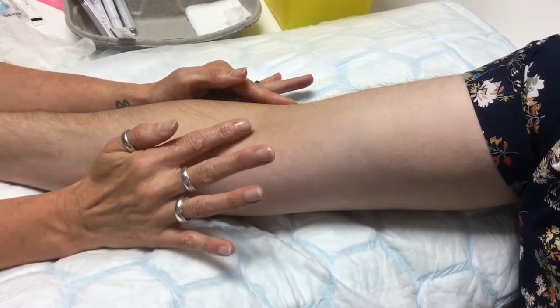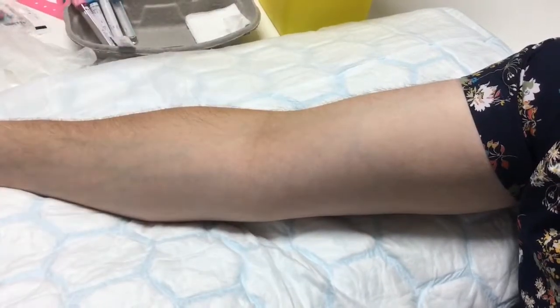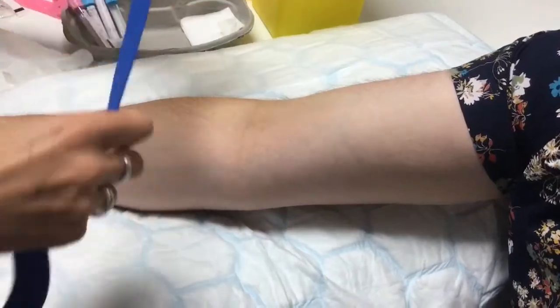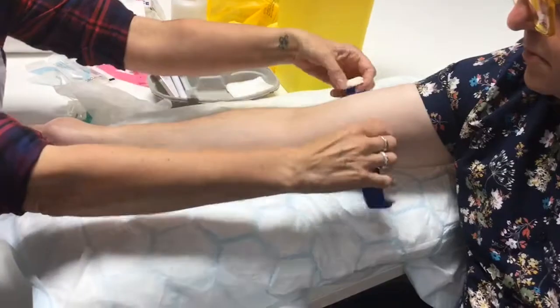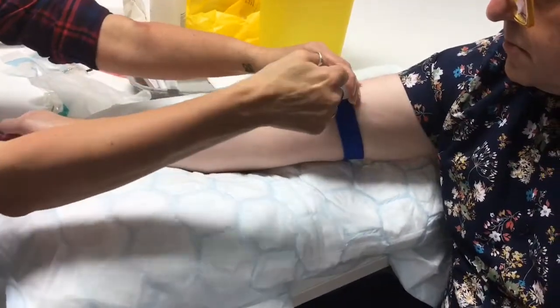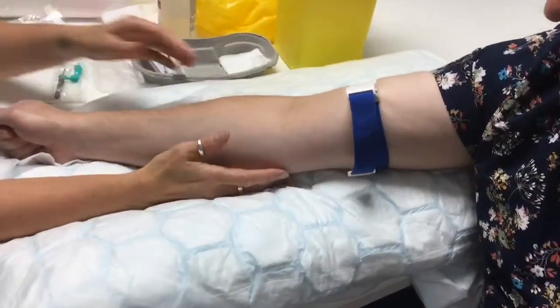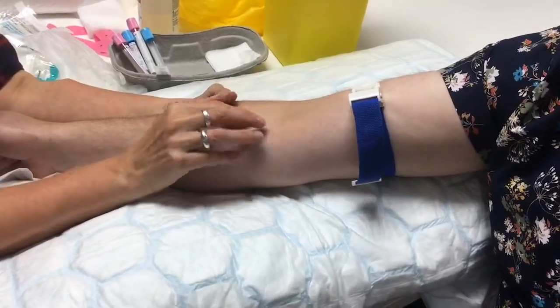We're going to take blood using the vacutainer here, or you can use the butterfly in that area as well. I'm going to pop my tourniquet on just to bring the vein up a little bit. You should never leave a tourniquet on for very long because it can be uncomfortable. Please tell me if that's too tight. Just give it a couple of minutes to come up and hopefully it should be easier to palpate.